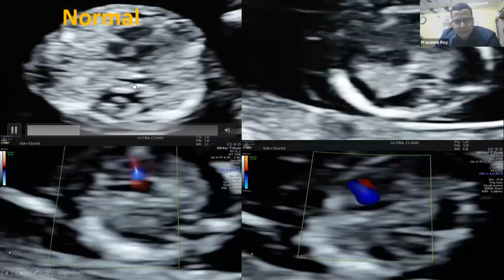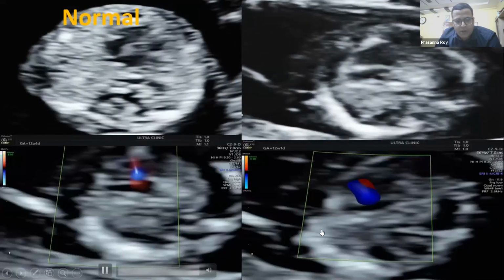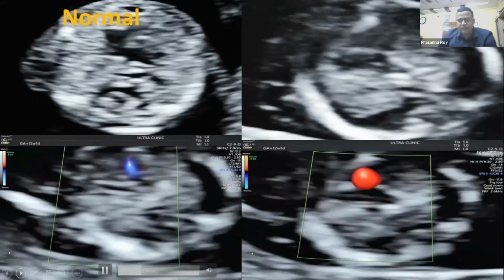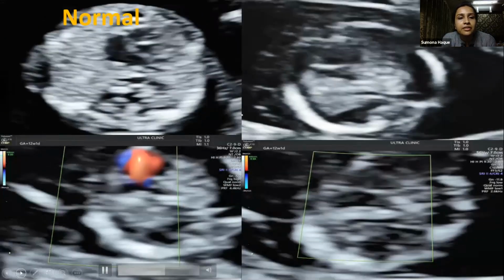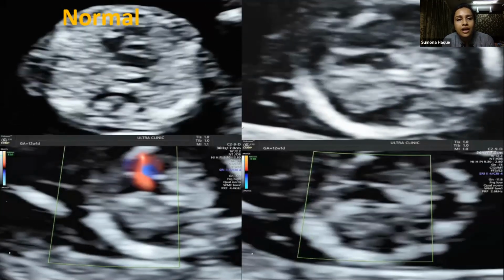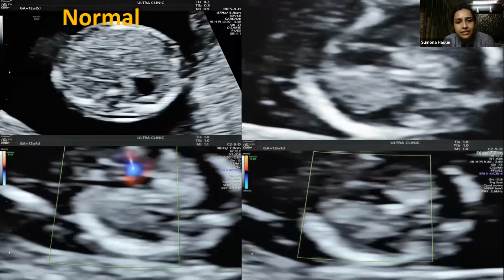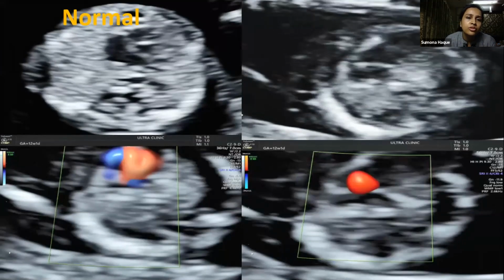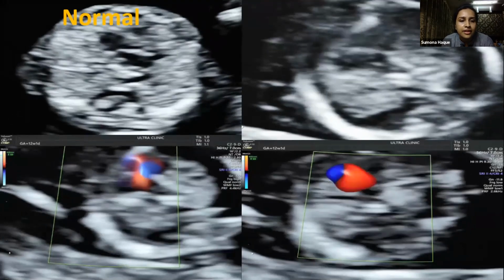So this is a normal 4-chamber heart which we are playing. This is the abnormal grayscale, and this is the abnormal power Doppler. This is the abnormal color Doppler. Okay, so after confirming the situs and the axis of the heart, I will look right into the center of the heart and see whether there is a defect or not. And here I can see a defect, which is more prominent during diastole. And during systole, I can see that the valves are more linearly inserted rather than the tricuspid valve, which should be more apically placed.